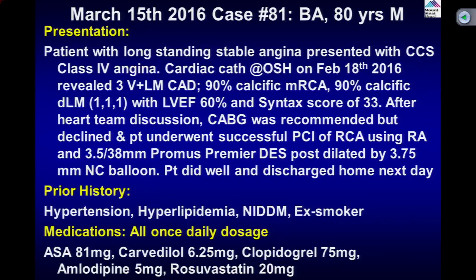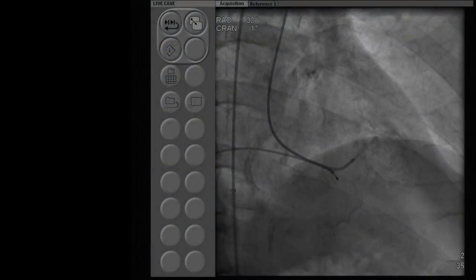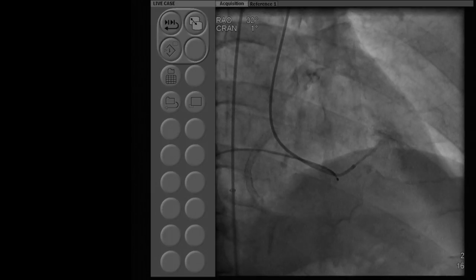The patient came here, Dr. Kinney did the RCA PCI, and we are going to talk about the LAD, left main, LAD, circumflex today. Very calcific lesions on appropriate medical therapy, and we'll just show you that angiogram. LV is near normal.